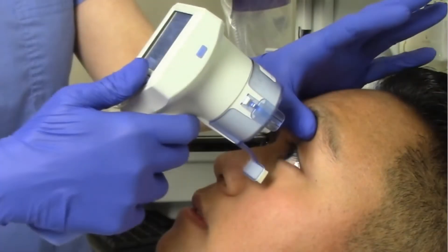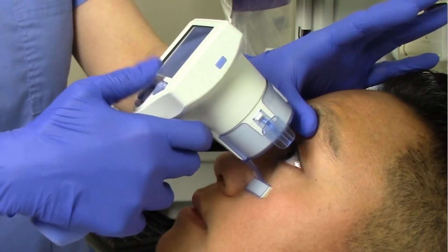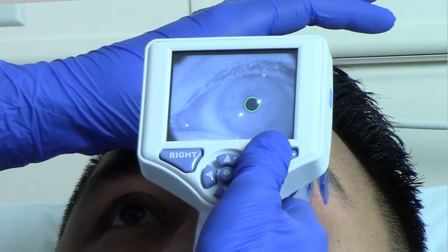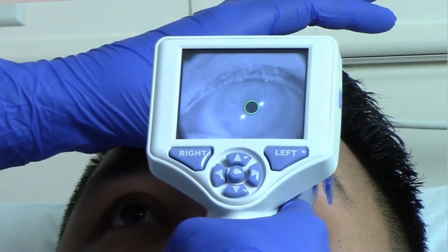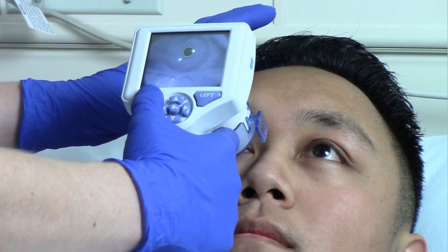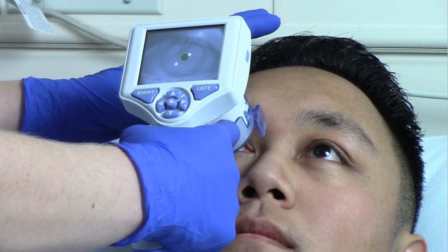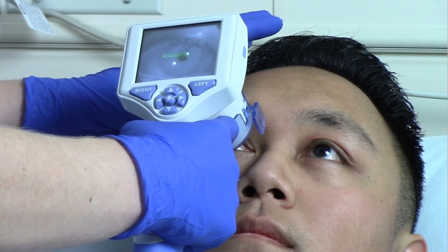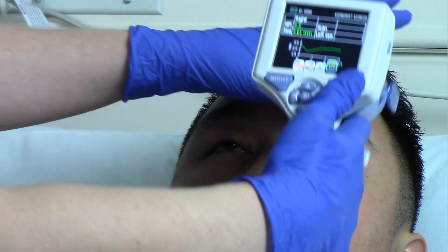To begin the measurement, position the Pupilometer with the smart guard at a right angle to the patient's axis of vision, minimizing any tilting of the device. Remember, the Pupilometer right and left buttons are oriented to the patient's eye being measured. Press and hold either the right or left button until the eye is centered on the touch screen and the display shows a green circle around the pupil. Once the green circle appears, release the button and hold the NPI 200 in place for approximately 3 seconds until the result screen is displayed.